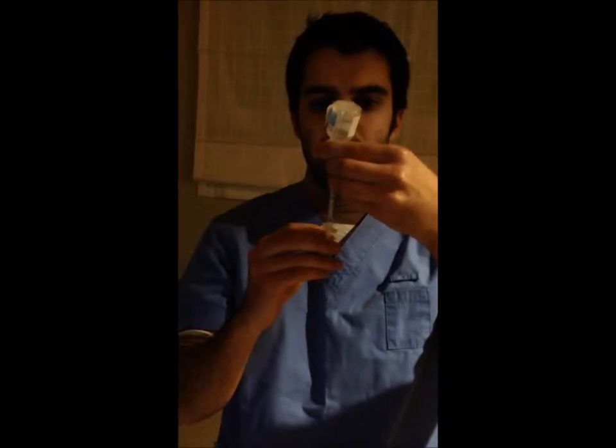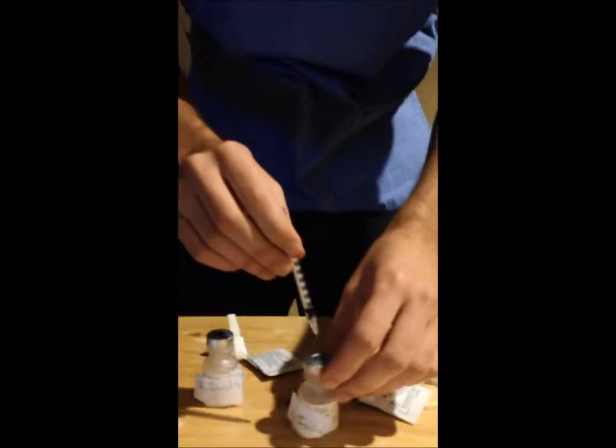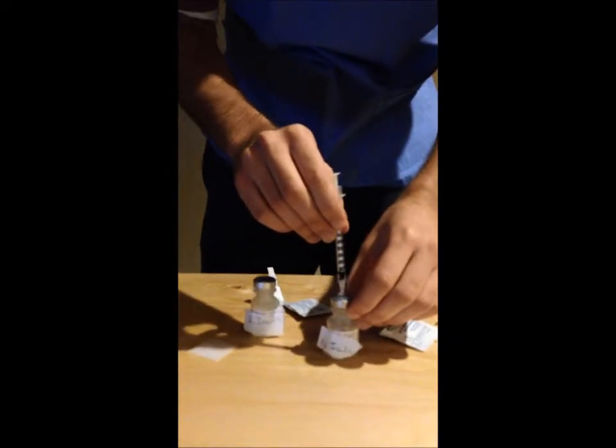And now I'm going to draw up 4 units. So 4 units of insulin right there, as you can see. And now I'm going to draw up the rest of the insulin. So it should be 16 more units for a total of 20 units of insulin.